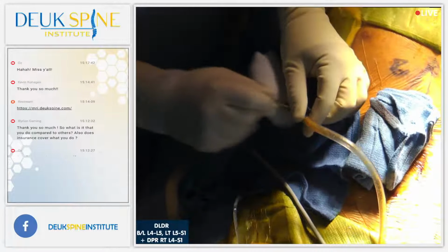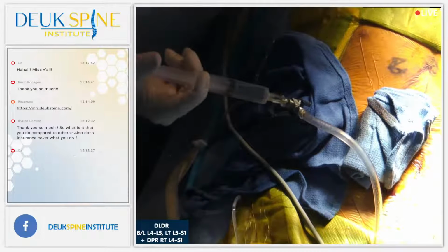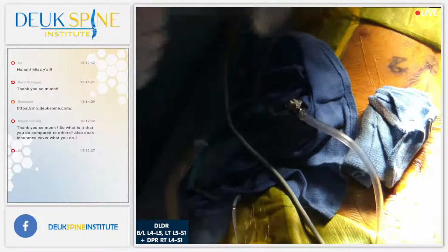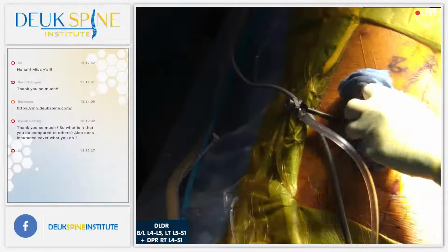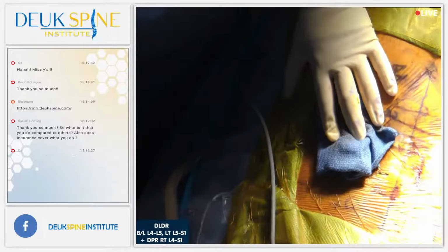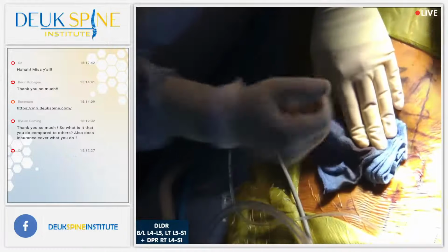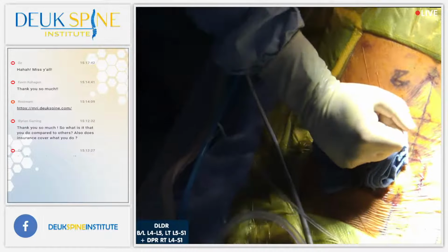You know, I think the greatest bit of evidence that discs do hurt is that right there. I'm literally lasering just the final fibers on the outside, and patients that are awake enough, they feel it. And it hurts. It's highly localized pain, you know what I mean? So it's amazing that doctors can ignore the fact that disc pain is so localized, so specific. They call it non-specific pain. It's not non-specific. It's specific. They just don't know where it's coming from.